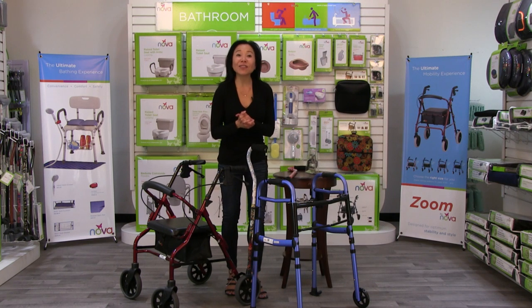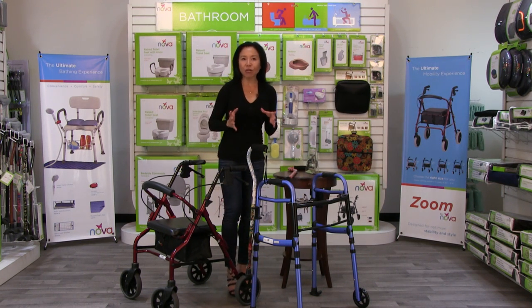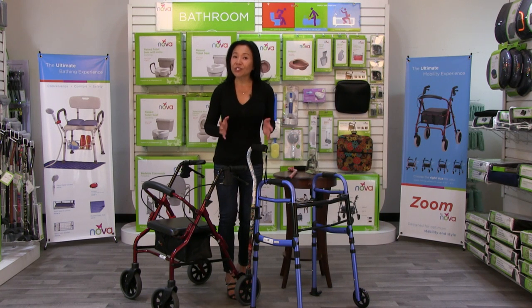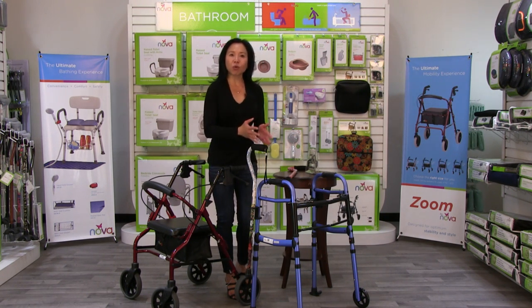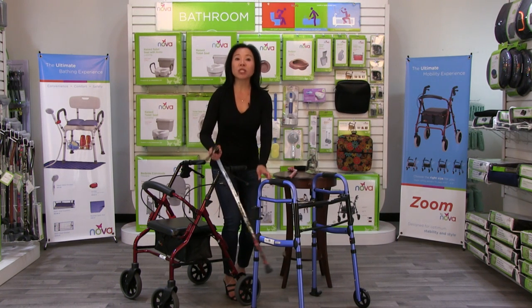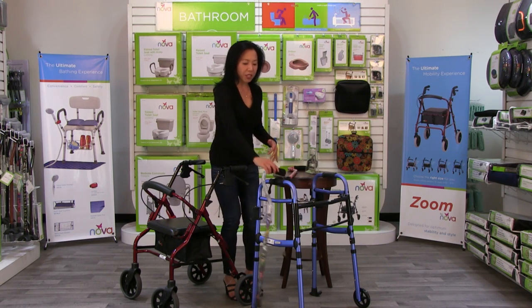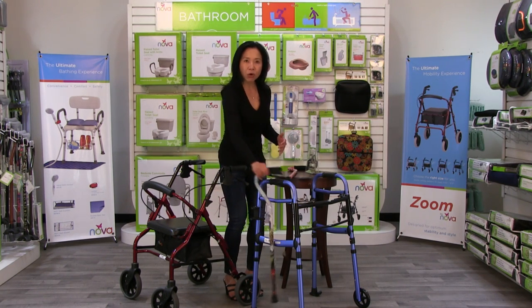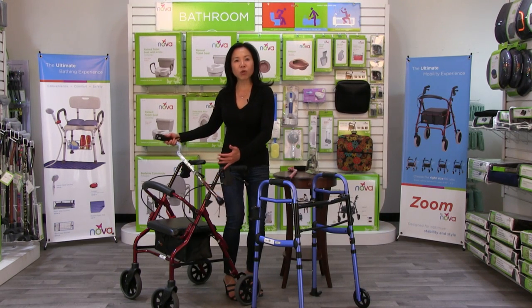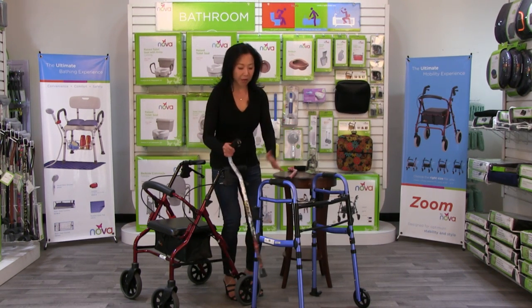Hi, Sue Chen here. This video is about the Nova CH-4000 cane holder. What this cane holder does is it allows you to have your cane and your walker together, streamlined. It's very common that someone is going to use a cane and a walker together, and I see people hanging the cane across their rolling walker — that's just not streamlined and the cane could fall down.